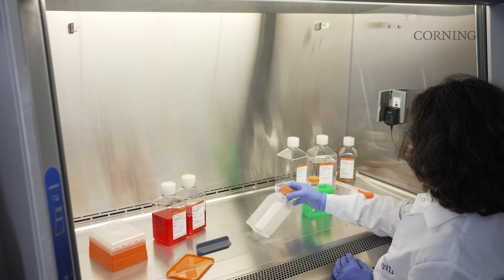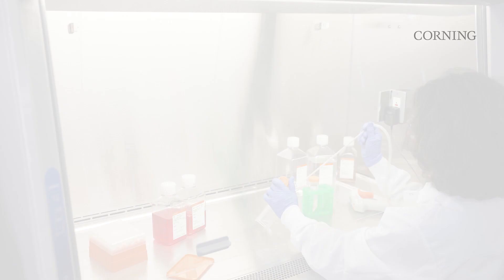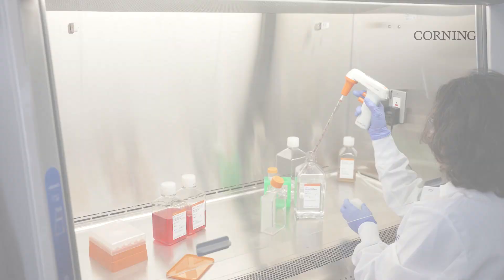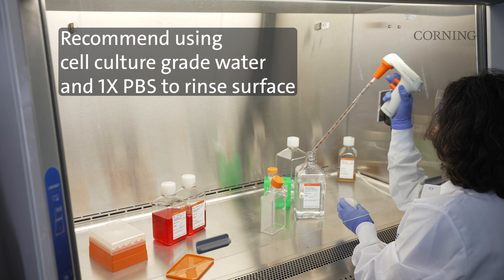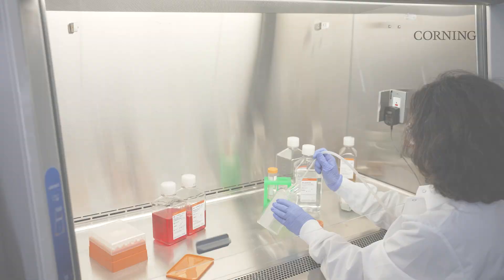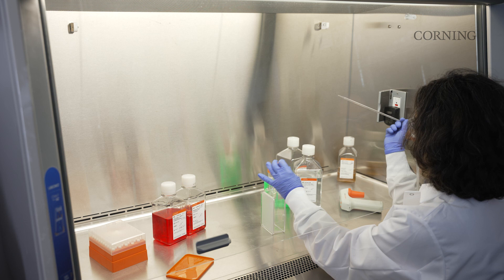To remove the wetting agent, bring the flask back to the upright position and aspirate. The micro cavity surface should be rinsed several times with water and 1x PBS to remove residual traces of the wetting agent prior to seeding cells. The flask can now be used to seed cells immediately, or can be stored temporarily in a biosafety cabinet or cell culture incubator until cells are ready for seeding.